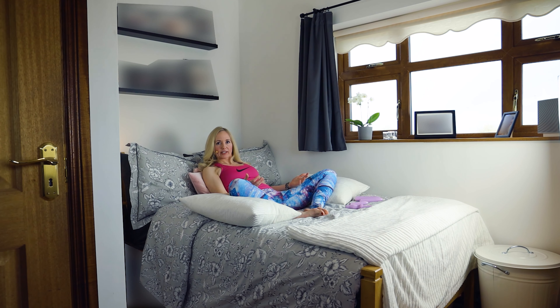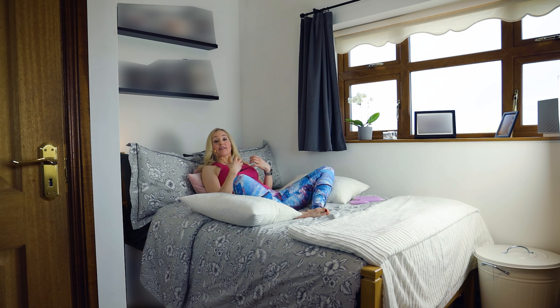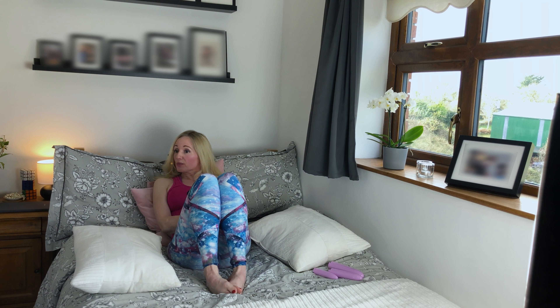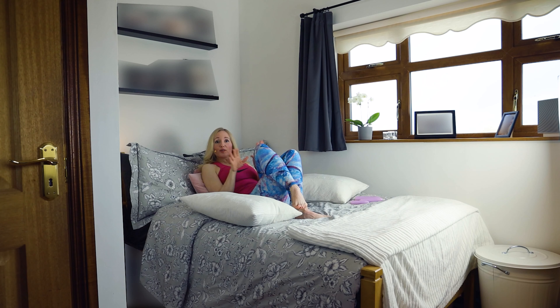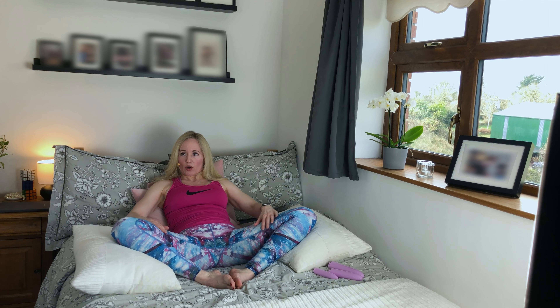In this position, I can allow everything to relax, and then with the smallest dilator you can start. Before you start — these adductor muscles are the ones that close your legs. They are like a protective muscle. Along with the pelvic floor, if the nervous system doesn't feel safe, they're going to want to close the space and not let anything in. If you're trying to overcome vaginismus, you want to be able to relax and open like a flower rather than closing everything up. So start with a little bit of massage just to let them go, and try to bring a state of calm.